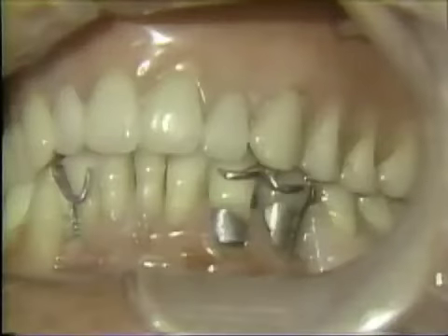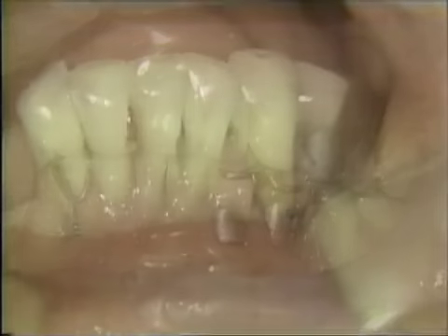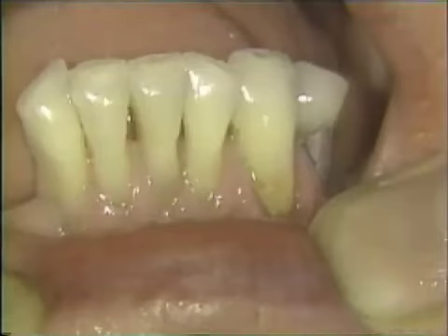The purpose of this videotape is to illustrate the technique of replacing a corroded cervical amalgam with composite resin. A sandwich of glass ionomer cement liner and composite resin will be bonded to etched enamel, dentin, and cementum. Layers of different colored composites and color tints will be used to color match the different areas of the tooth.